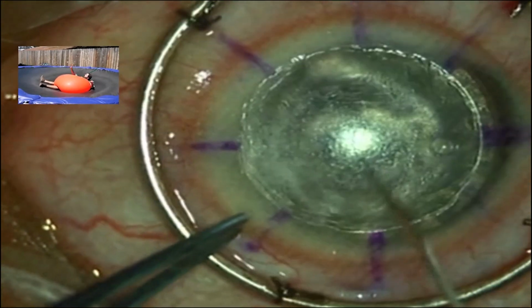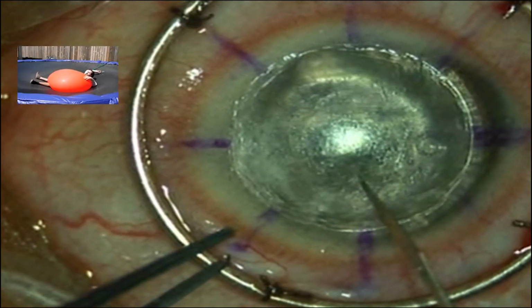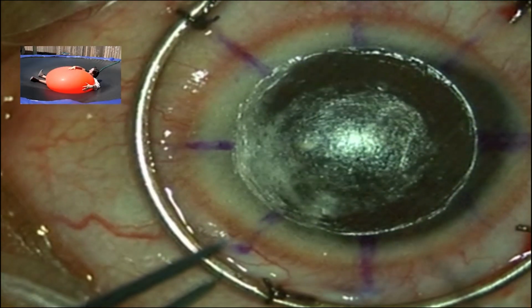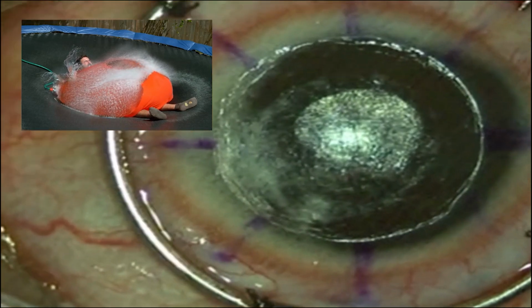Using a 15-degree disposable knife, de-roofing of the big bubble was attempted. Another attempt at puncturing the bubble perforated the Descemet's membrane with resultant flow of aqueous.